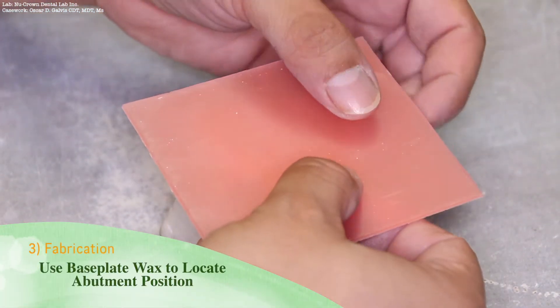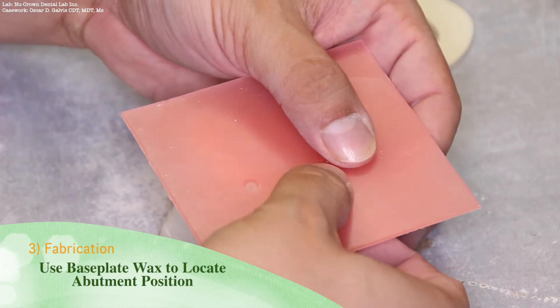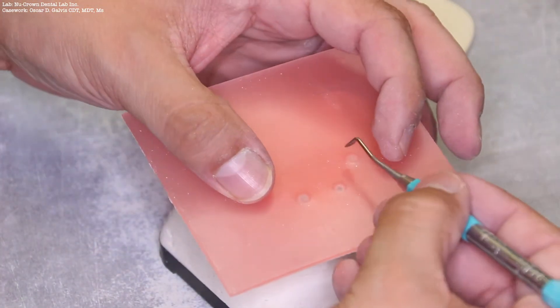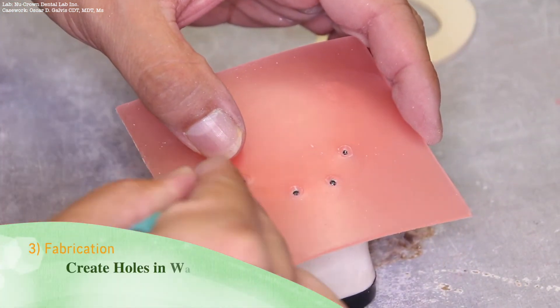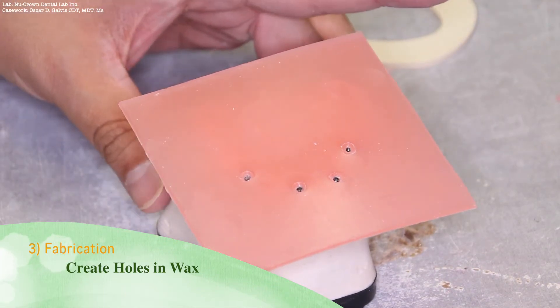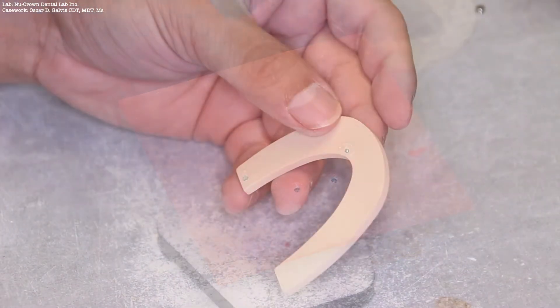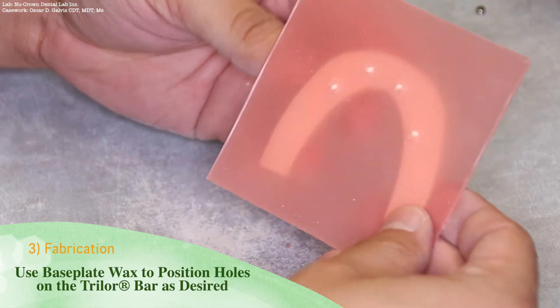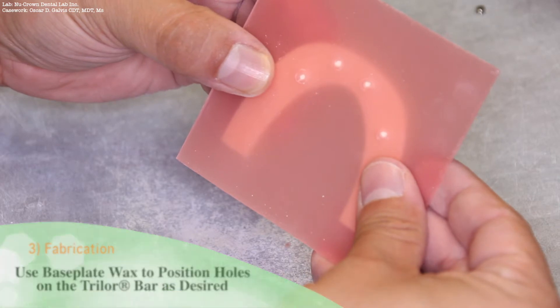Take a sheet of hard base plate wax and press it down on top of the abutments. This will help in locating the abutment position on the Trilor substructure. Be sure to create holes in your base plate wax. Once the holes have been marked, use the base plate wax to position the holes on the Trilor bar as desired.